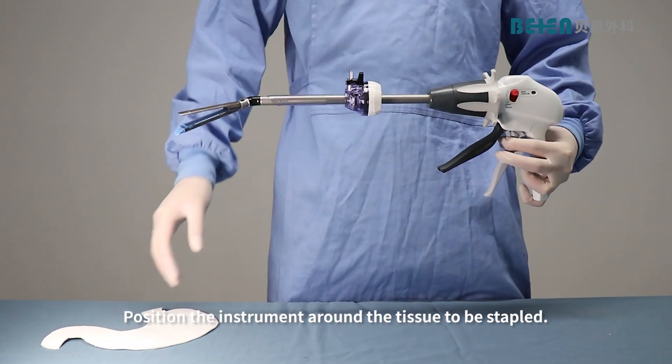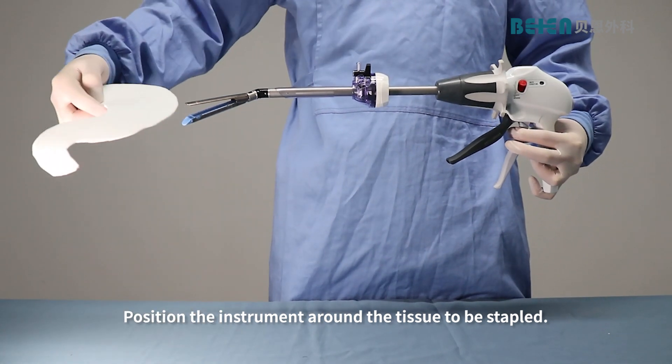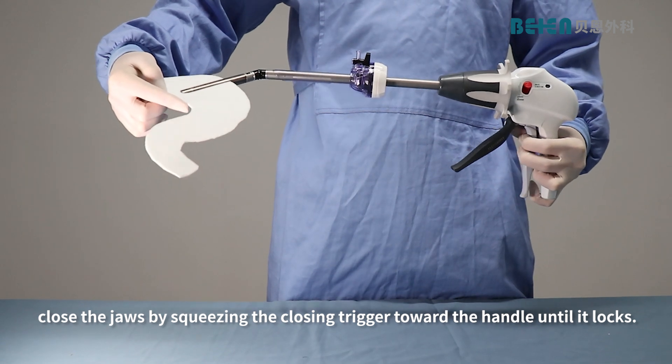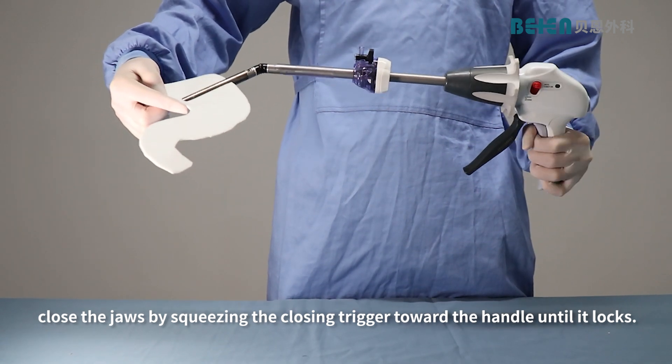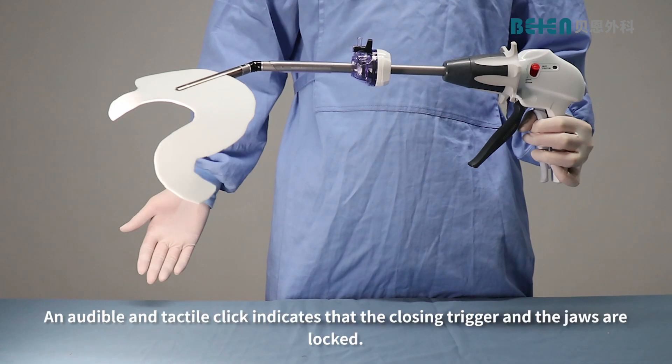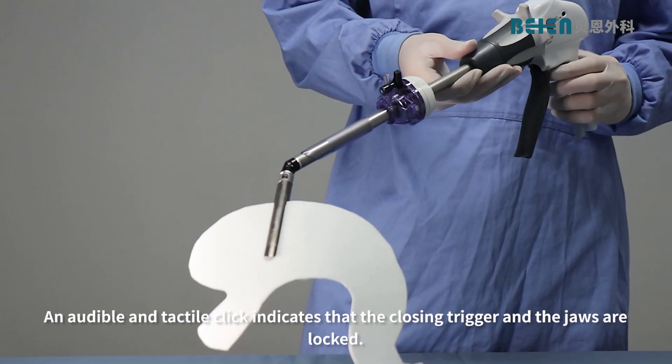Position the instrument around the tissue to be stapled. After positioning the instrument jaws, close the jaws by squeezing the closing trigger toward the handle until it locks. An audible and tactile click indicates that the closing trigger and the jaws are locked.